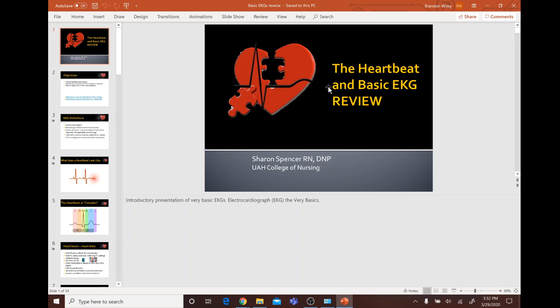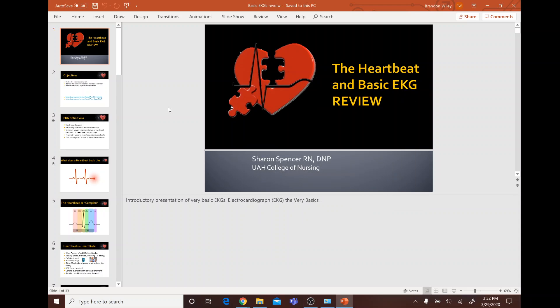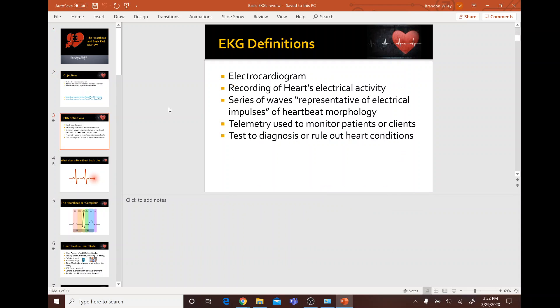We're going to go over some basic EKGs and get a review so we have updated knowledge on it. An EKG is a recording of the heart's electrical activity that represents a series of waves of heartbeat morphology.